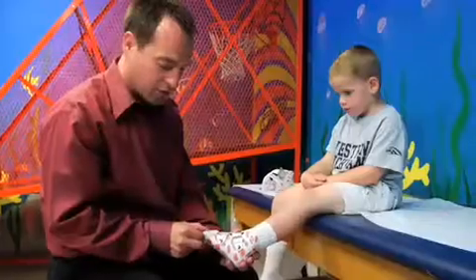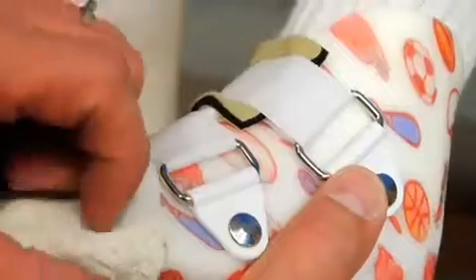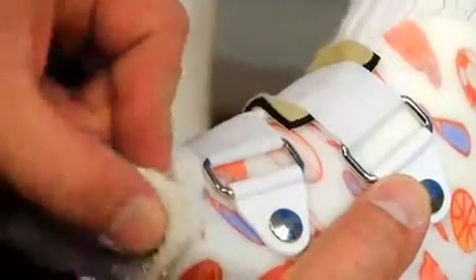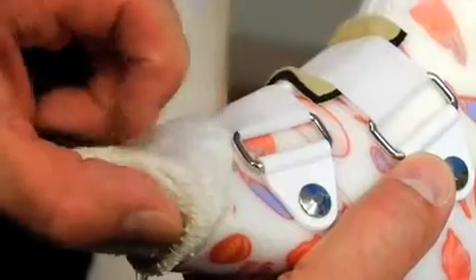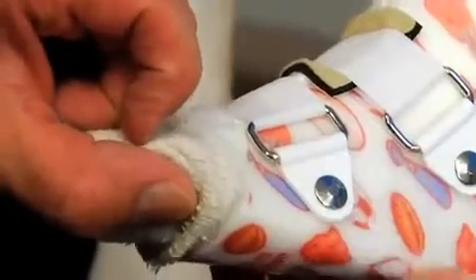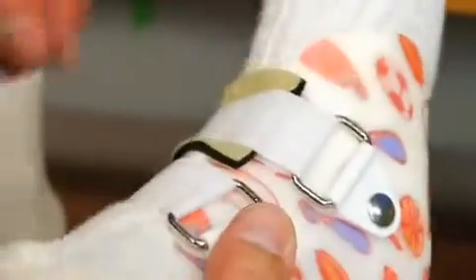We need to check our trim lines to ensure that they were trimmed back correctly. We're going to check the lateral trim line to ensure that the fifth toe can freely dorsiflex and it's not going to restrict its movement. And on the medial side, that the first metatarsal is completely free and that the trim line is in soft tissue.